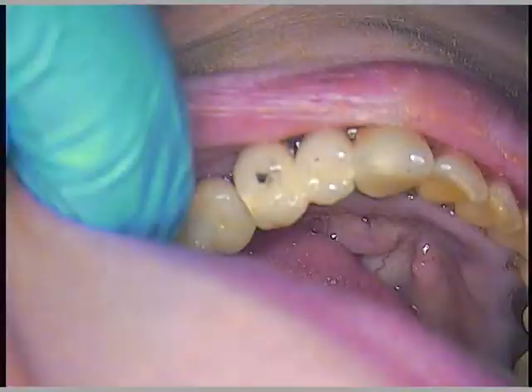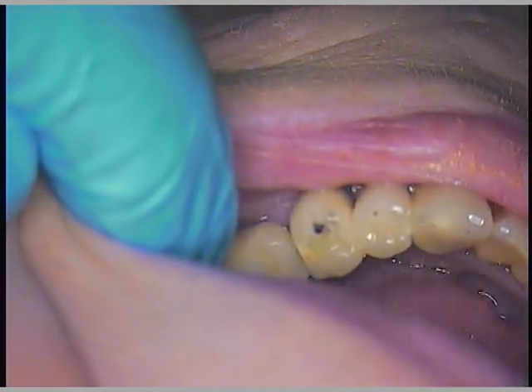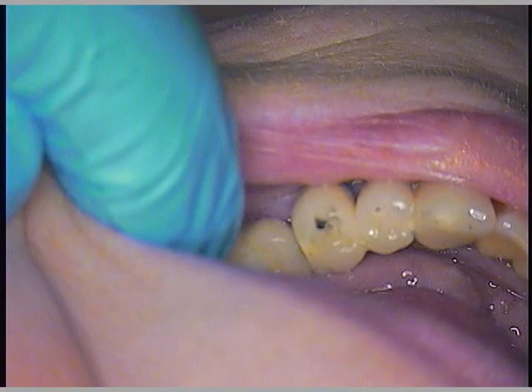I don't know yet — I'm going to find out if it is all gold. I'd be happy to hand it to you if it is. And in the mouth, here we are: we've restored a contact, the middle of the tooth is plugged beautifully, and we do have Teflon tape in there.